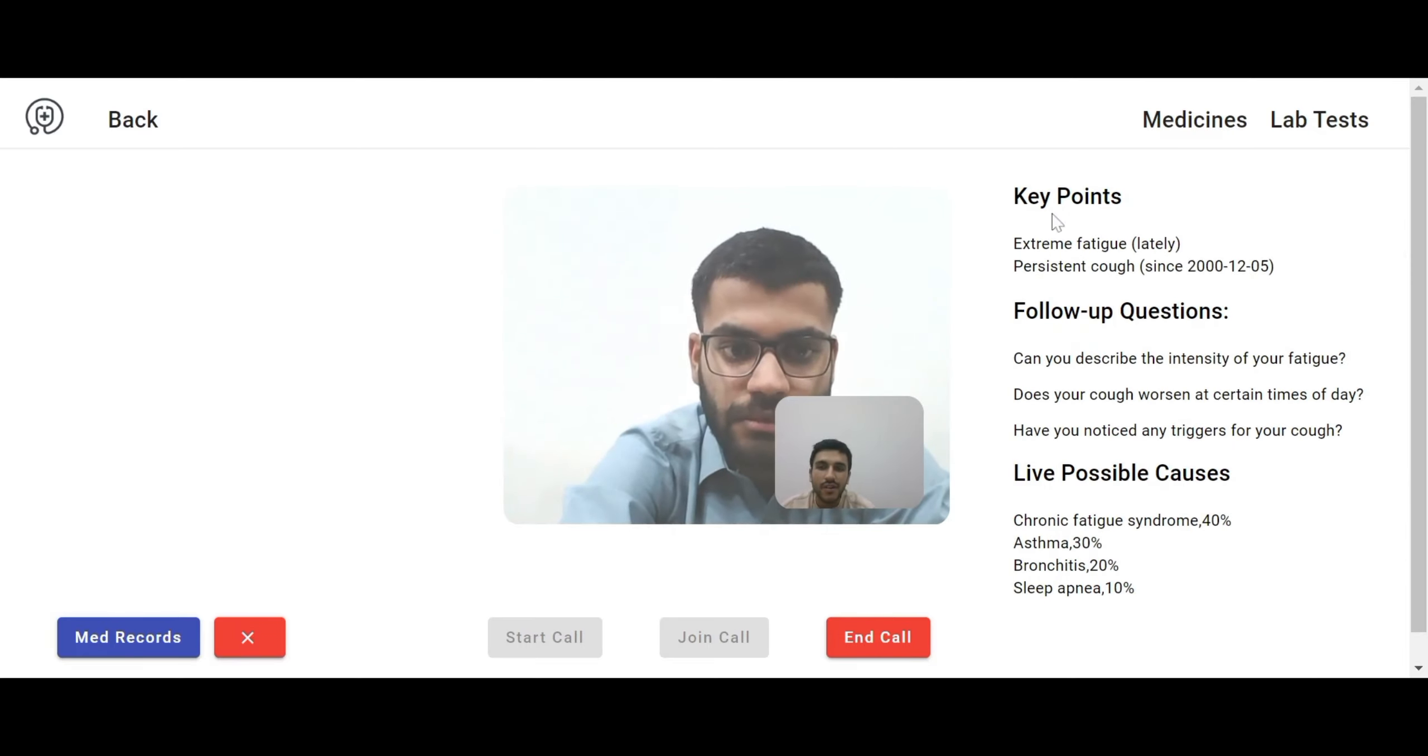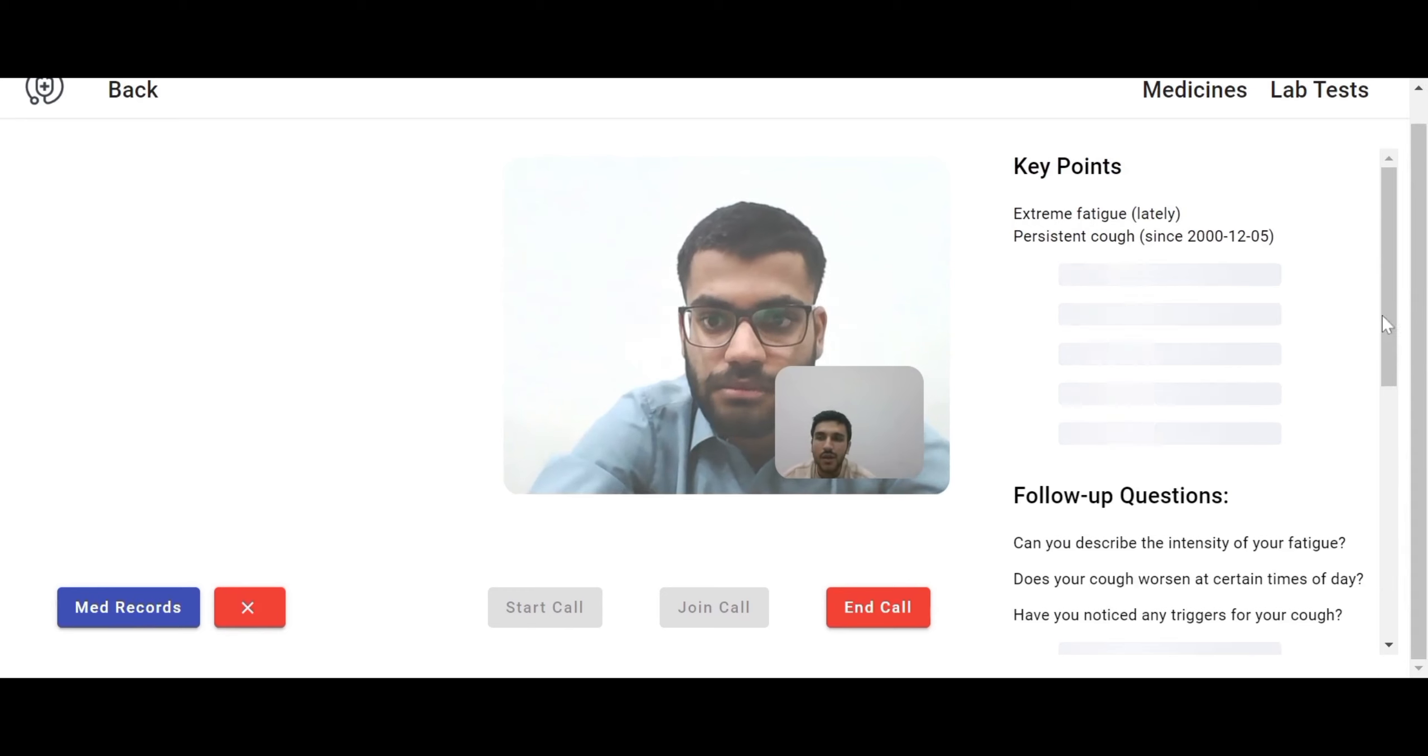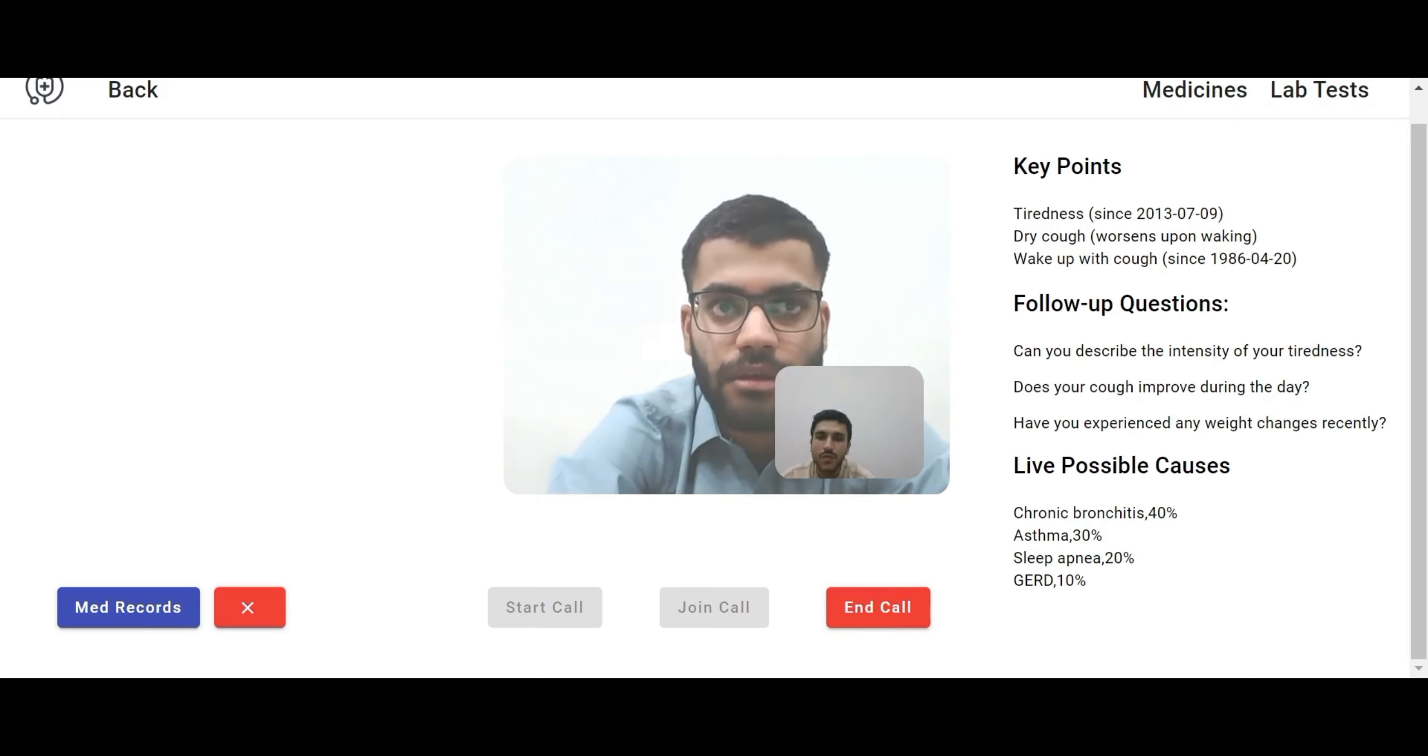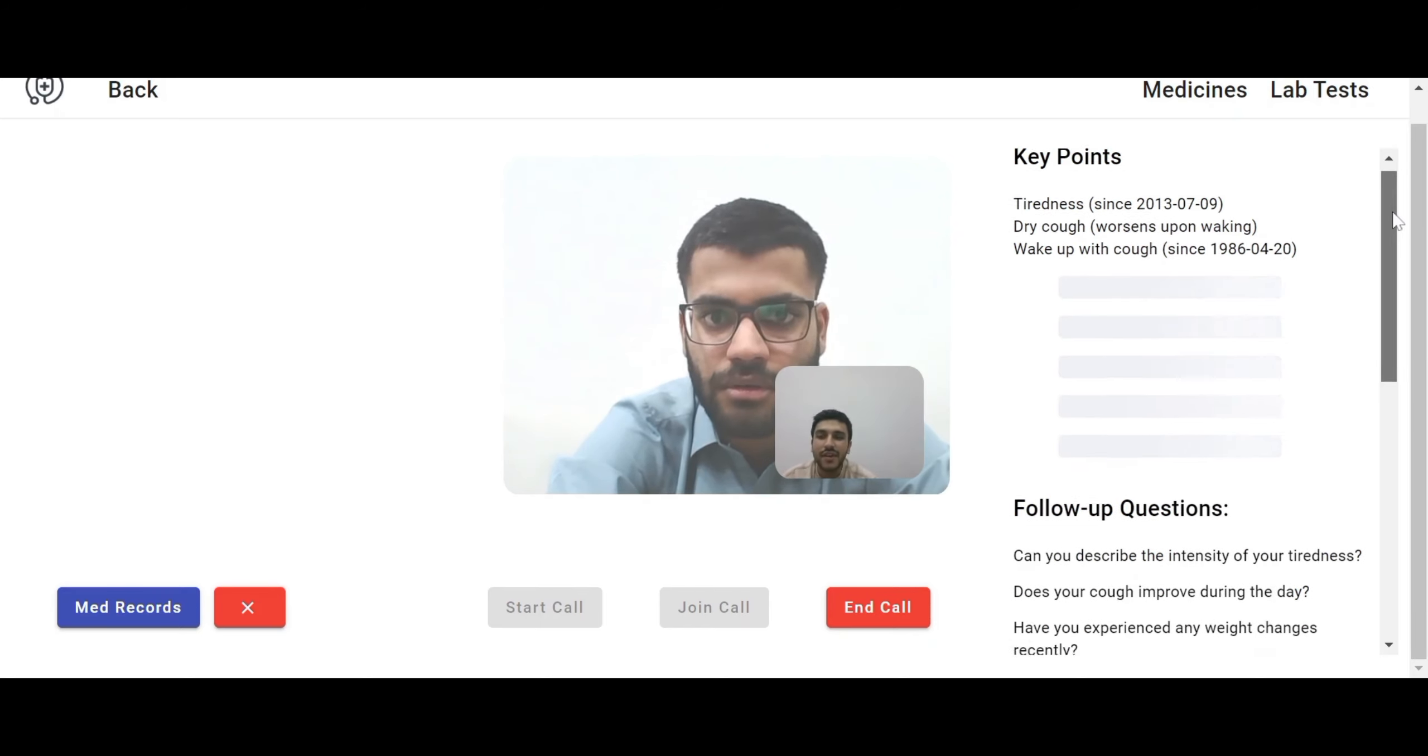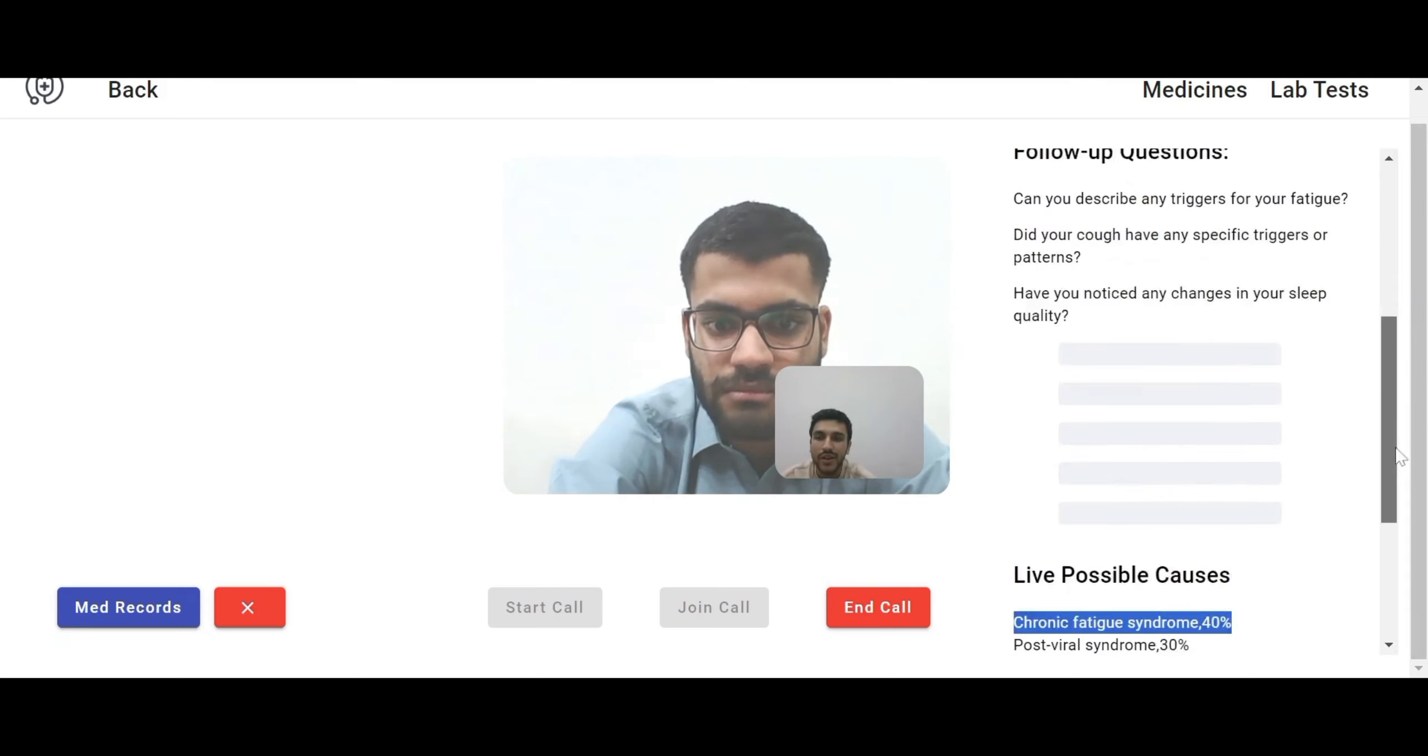As you can see on the right side, the key points, follow-up questions and the live possible causes are coming and right now I am going to ask some follow-up questions from the patient. Can you describe the intensity of your fatigue? Basically it's on a level of 1 to 10, it's 6. It's really bad for me. Right now my key points are loading and according to what patient is saying, the key points are updating its values. Did your cough improve during the day? Yeah, in the day it's pretty much good but at the night time it's very hard for me because I am having a very mild type of cough in the night. Have you experienced any weight changes recently? No, there is no weight change in the past few weeks. That's great. As you can see, the AI is again responding me with the key points and the live possible causes and the follow-up questions. As you can see, in the live possible causes, the disease that it is mentioning with the most probability is chronic fatigue syndrome. As the patient explained in timely manner that he has chronic disease problem of fatigue.